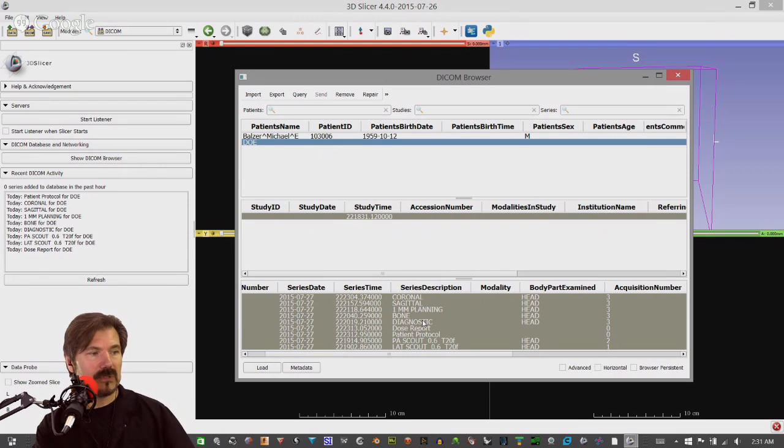And if you have some choice, which more likely you won't, unless you're a researcher like Javin, you can identify to the radiologist, since he is a radiologist, he can order himself for the technician to provide a balanced full-scale scan. And, Javin, you're welcome to jump in at any time if I get something wrong. No, I'm sorry, Mike. No, go ahead.